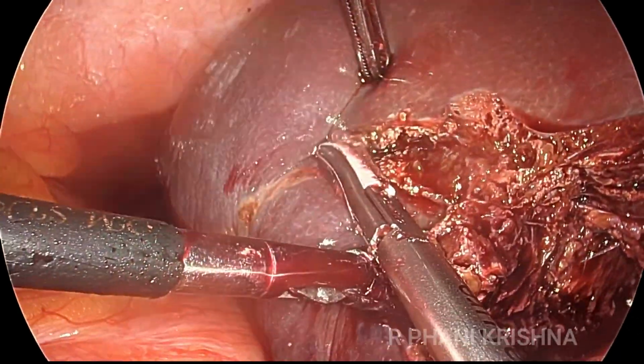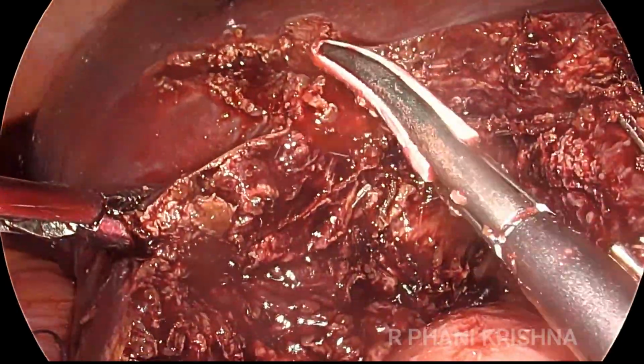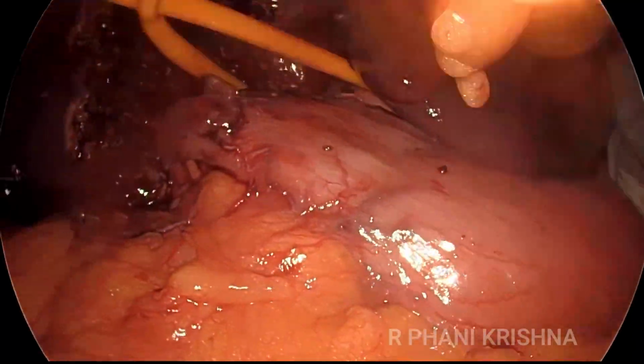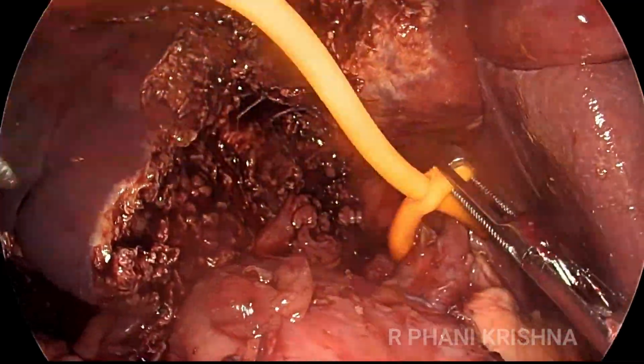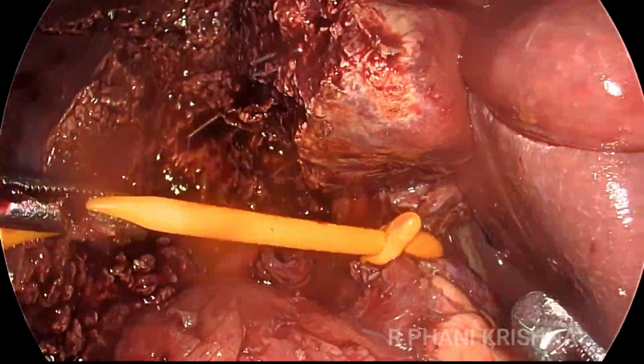So now as we do the majority, we try to do as much as possible from the right side, and whenever we encounter some bleeding there, we do the inflow Pringle with the Foley's catheter which we placed.